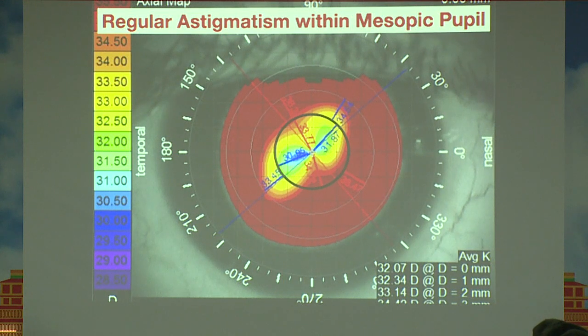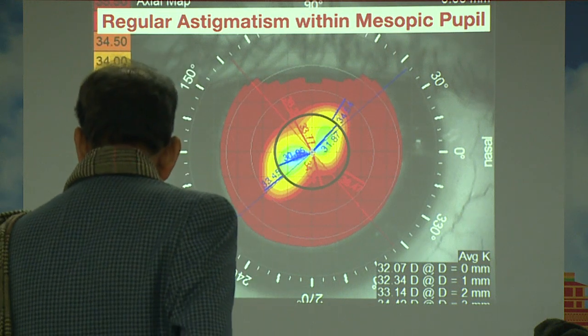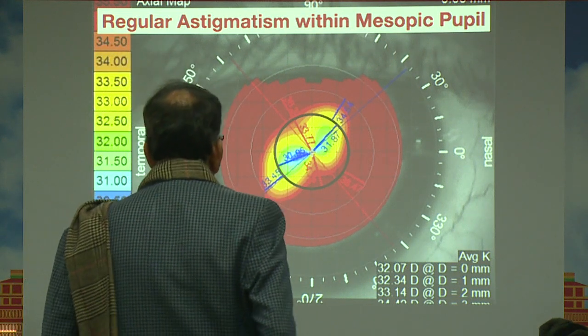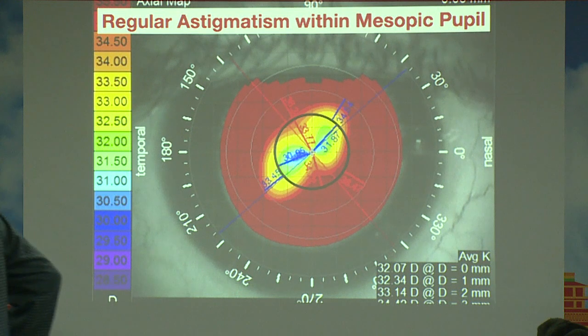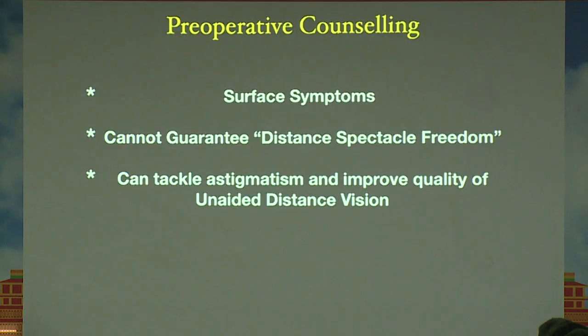And with this patient, I wanted to understand what we learned in our clinics, which was the fact that what we're treating is just the pupillary cornea. We don't treat the whole cornea when we operate with the cataract. Only the part where the light goes through to cause that refractive correction is what we treat. So if the patient is regular in the pupillary area in his astigmatic profile, I think it's a good candidate to put a toric IOL because the rest of the cornea does not matter.